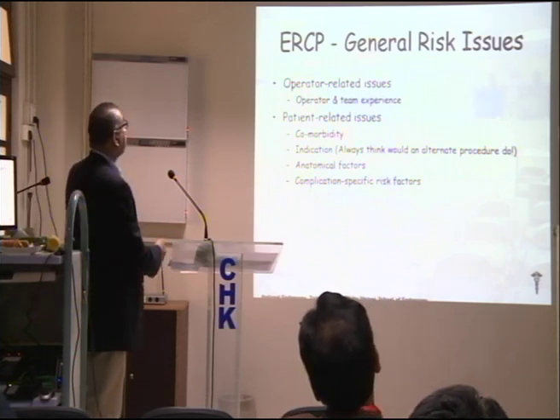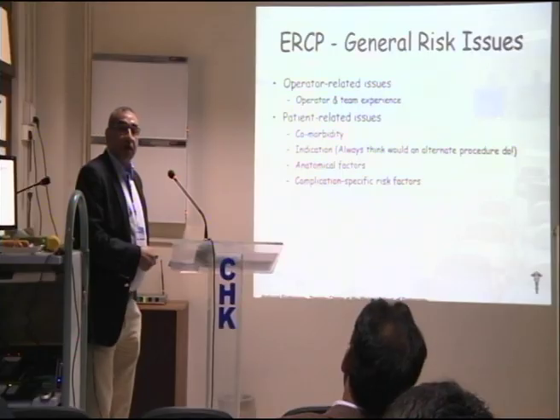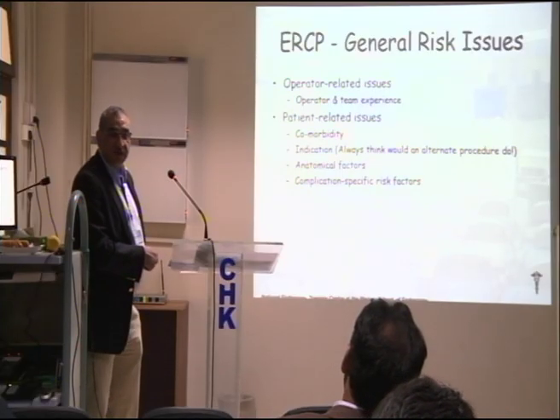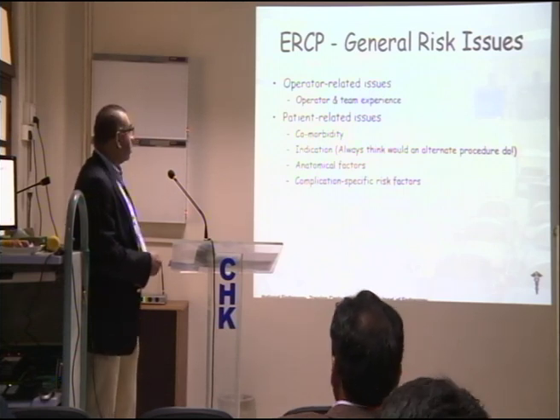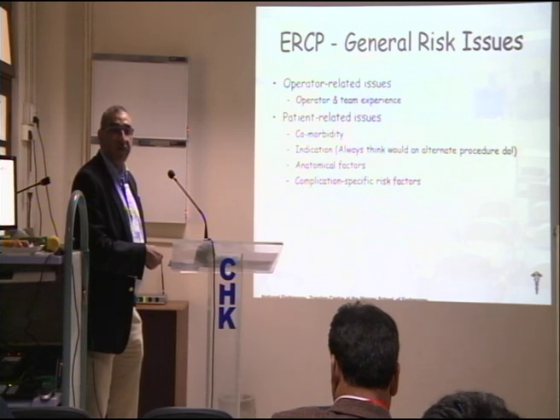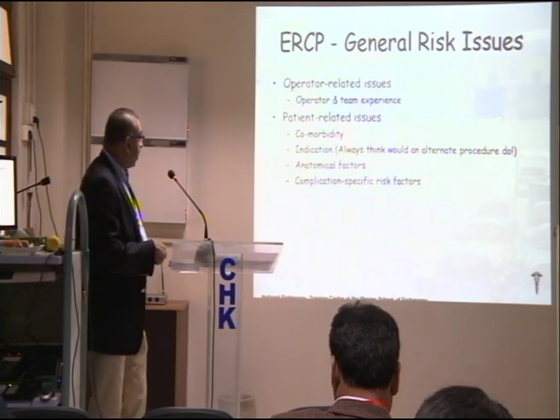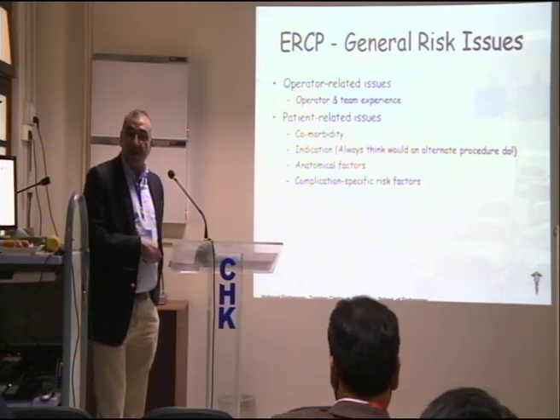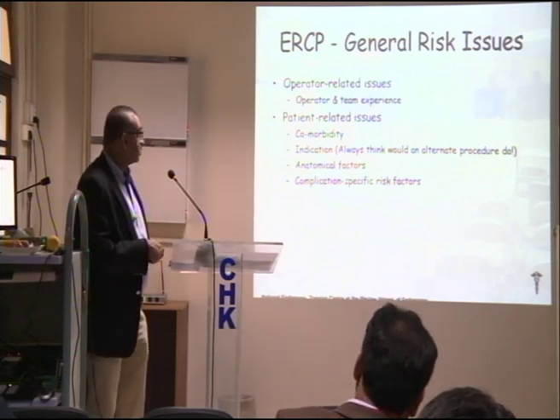You can't stress enough the importance of operator-related issues. If you are not qualified, not skilled enough to perform a procedure, don't do it. Send it somewhere else. Again, selection of your patients is very important, because if your patient has got severe COPD, is a post-myocardial infarction patient, has got heart valve replacement, has other risk factors, or might be suffering with acute cholangitis and in septicemic shock, all those are important and would add on to your complication issues.